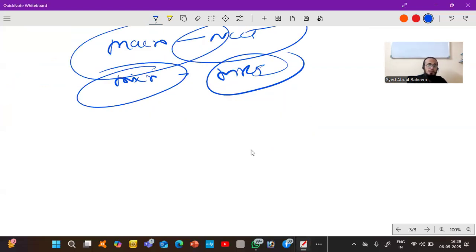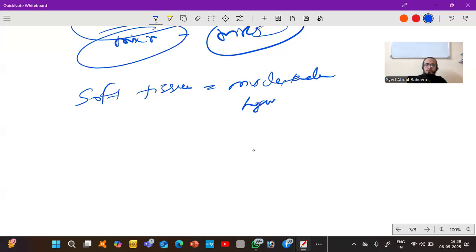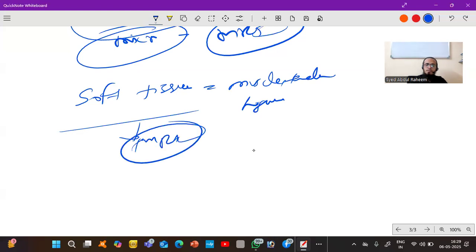Now, soft tissues like muscles, tendon, ligament, all these need MRI. Like the vertebral column, the disc. All this is disc prolapse, like a cervical problem. If you want to know which disc is affected, you have to go through MRI for soft tissue.